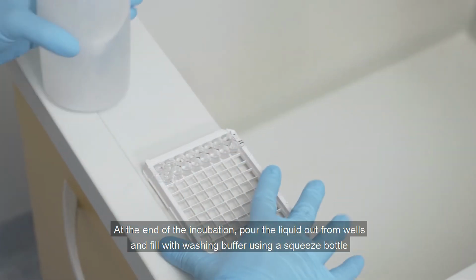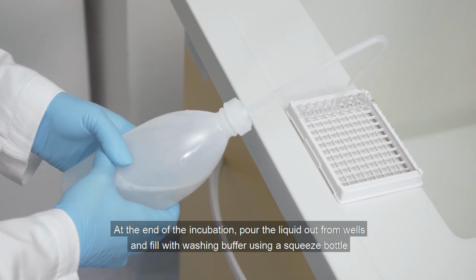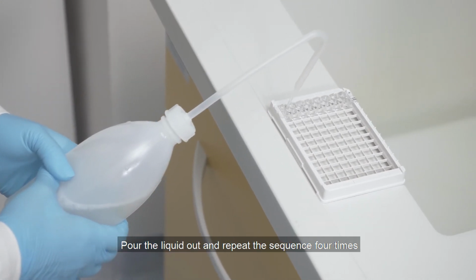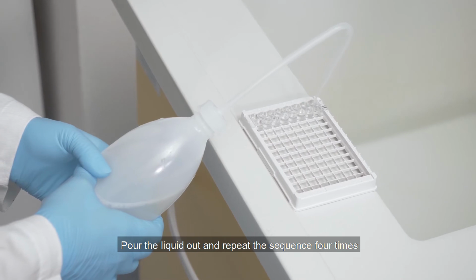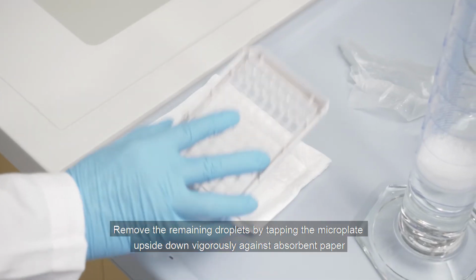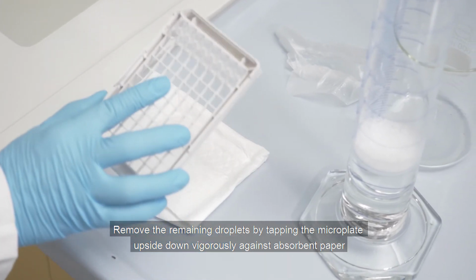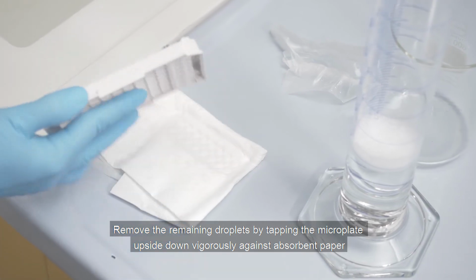At the end of the incubation, pour the liquid out from wells and fill with washing buffer using a squeeze bottle. Pour the liquid out and repeat the sequence 4 times. Remove the remaining droplets by tapping the microplate upside down vigorously against absorbent paper.